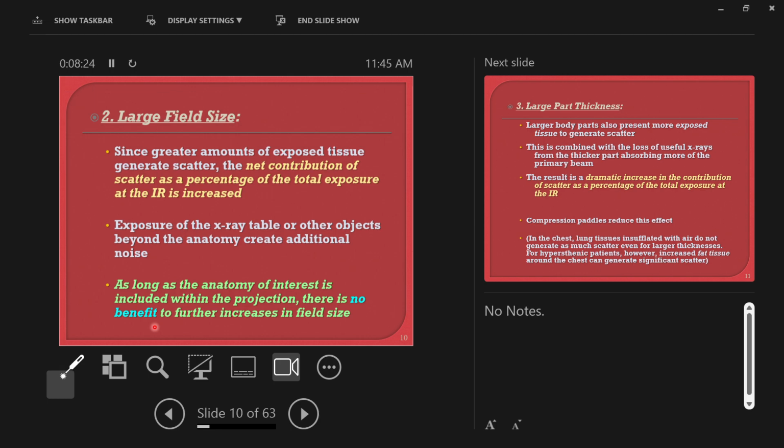Look how big this can be at 72 inches. Let's take 72 times 0.02. It's bigger, right? 72 times 0.02 is 1.44 inches. That's almost an inch and a half. Your light field can be as much as an inch and a half off of where your actual radiation field will be. This is why it's important to give yourself light around the anatomy of interest, never larger than the cassette, and always give yourself about an inch.